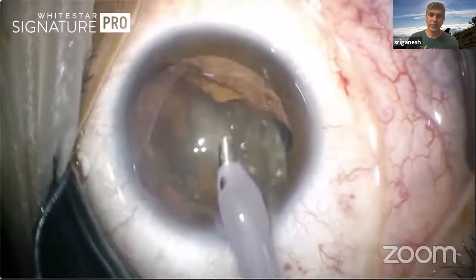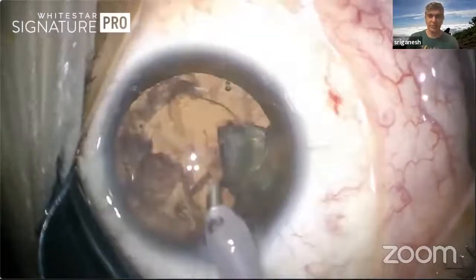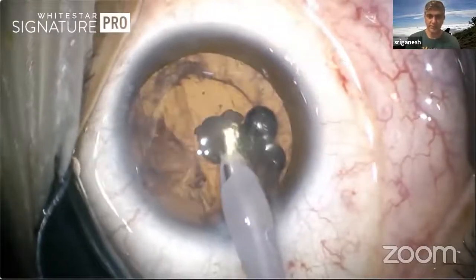And then you can just aspirate the fragments very easily. There is some amount of nucleus sclerosis in the center. So this is something you can expect in myopic patients, especially if they are older.